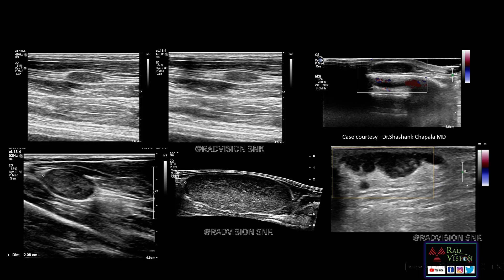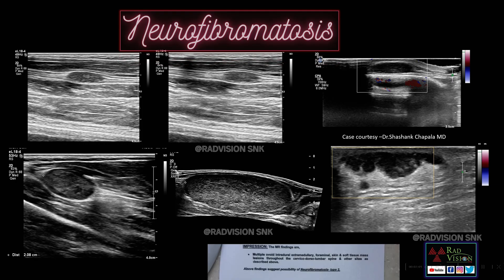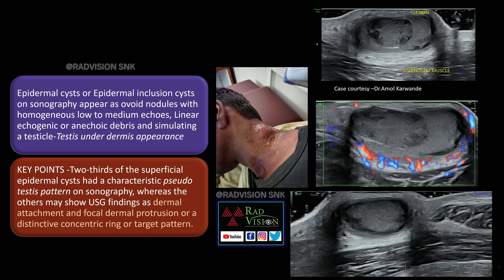These are other cases showing multiple neurofibromas along with intracanalicular schwannomas, ependymomas, and meningiomas — this was a case of NF2 (neurofibromatosis type 2).